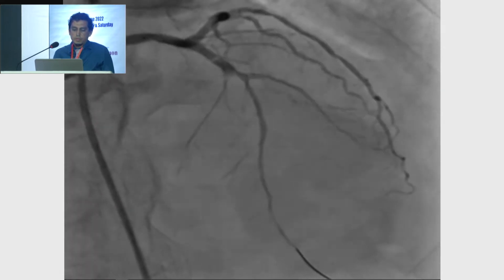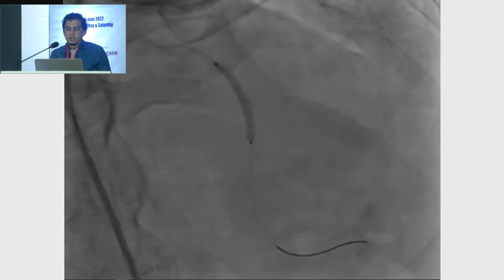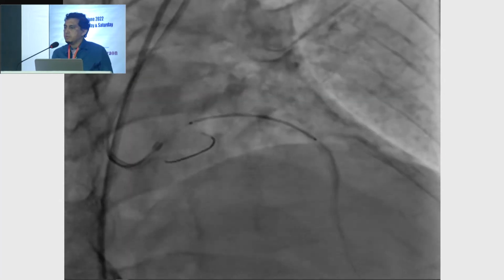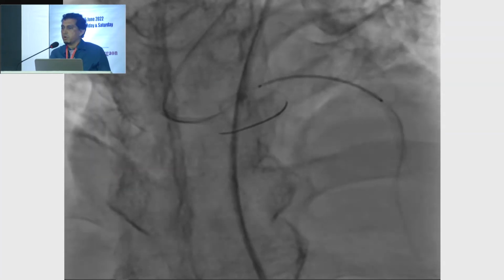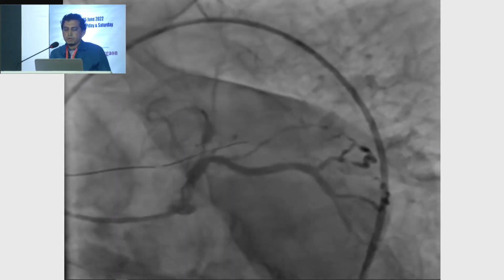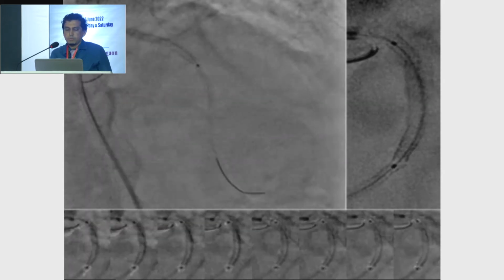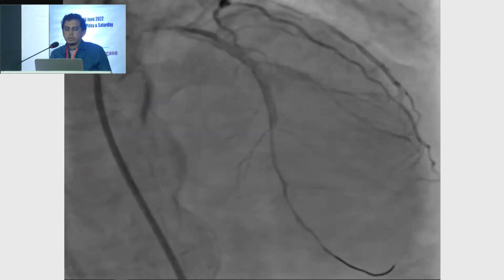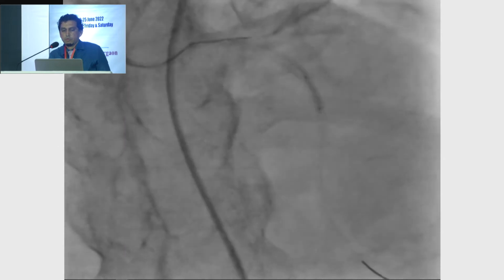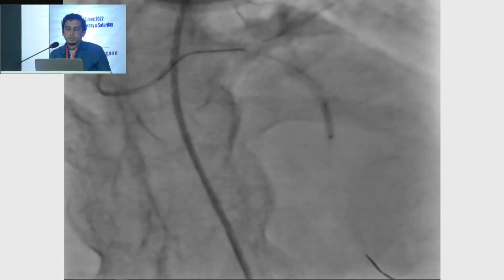So what happened? We put a distal stent 2.5 into 30, and overlapping the proximal lesion, we come across up to the ostium of the left main. And the proximal lesion we covered by 3.5 into 38. And we overlap with the proximal stent, and we make sure that nothing is uncrossed, so that you do not miss the ostium and not miss the overlapping also.